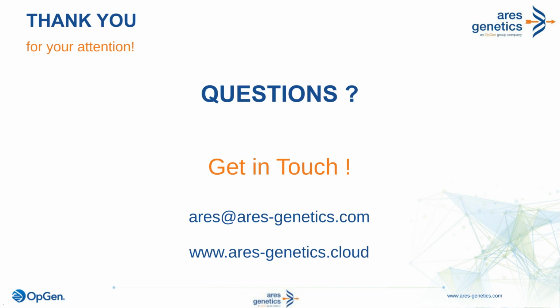So let's get started. Our first question says, thank you for this interesting presentation. Susceptibility from genomic data is indeed the next frontier if we want to see the adoption of NGS in the clinic beyond surveillance. I assume that the predictive models work well in pathogens like Staph aureus or E. coli, for which susceptibility is linked to the absence of well-characterized resistance genes. Could your AI-based approach also help predict susceptibility for pathogens or antibiotics with more complex resistance mechanisms?